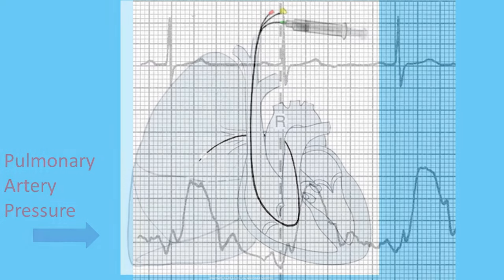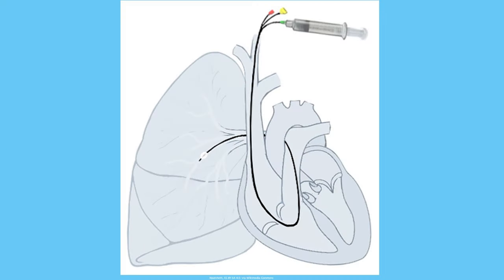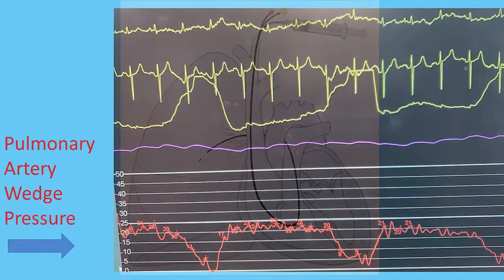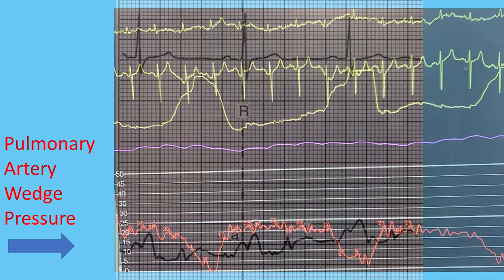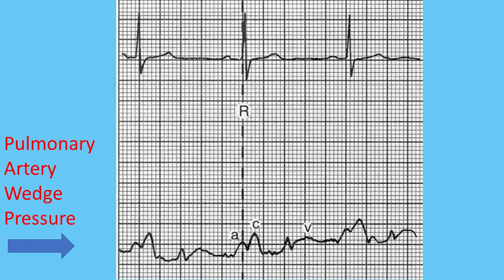I then inflate the balloon at the tip of the Swan-Ganz catheter and push it further into the pulmonary artery branches to wedge it and to get the pulmonary artery wedge pressure. This is the pulmonary artery wedge pressure that I see on the monitor in front of me, and here is a schematic representation of how it should look.